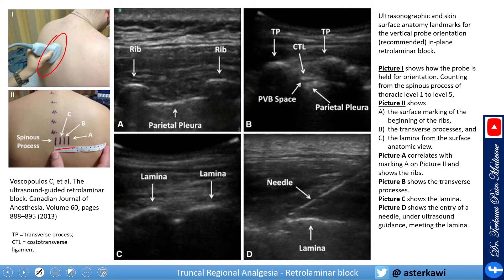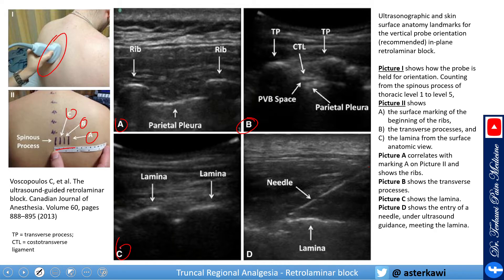Here are more pictures showing the same concept. This is how you place your ultrasound — you can use curvilinear or linear depending on the depth. For higher thoracic levels I would prefer to use the linear probe. From lateral position A you find the ribs, then in position B you see the transverse process, and in position C you see the lamina. You then bring your needle to touch the lamina and inject the local anesthetic.